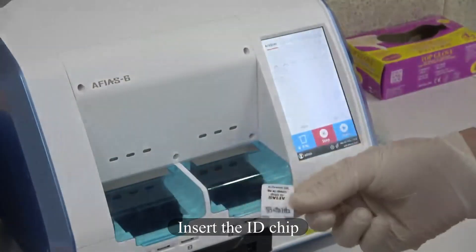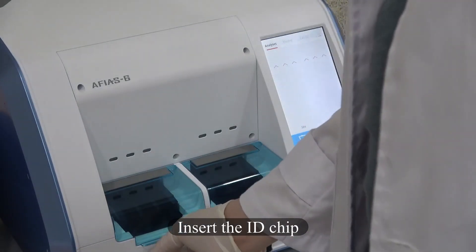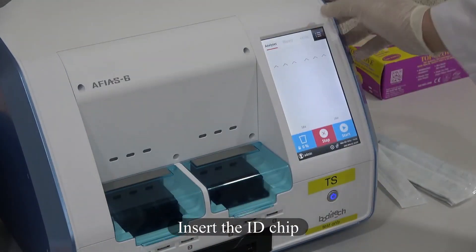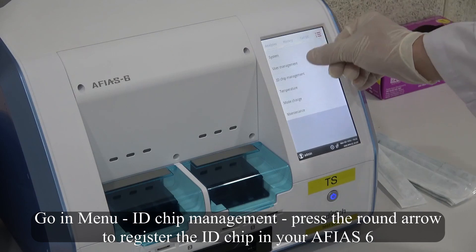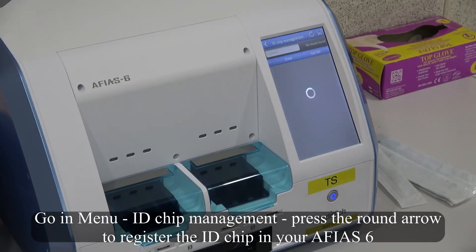Insert the ID Chip. Go into Menu, then ID Chip Management, and press the round arrow to register the ID Chip in your AFIAS 6.